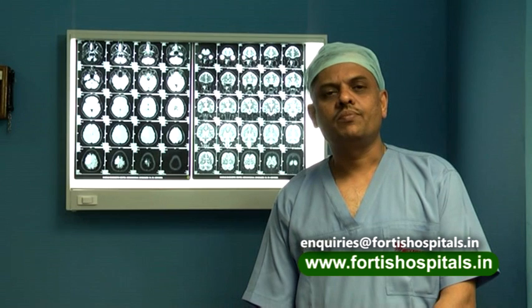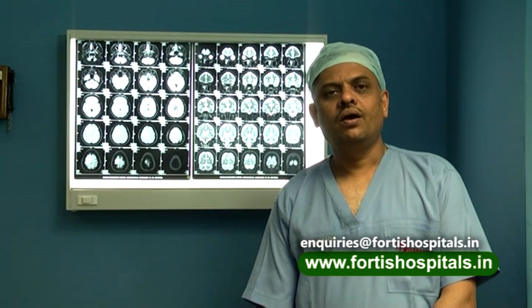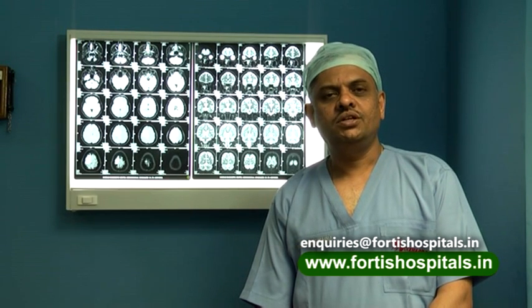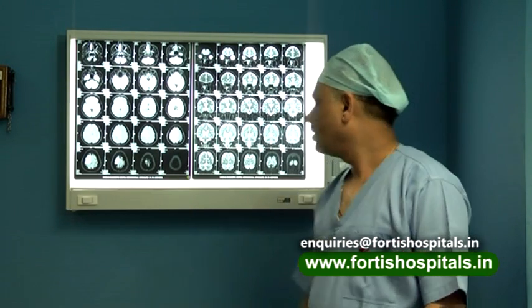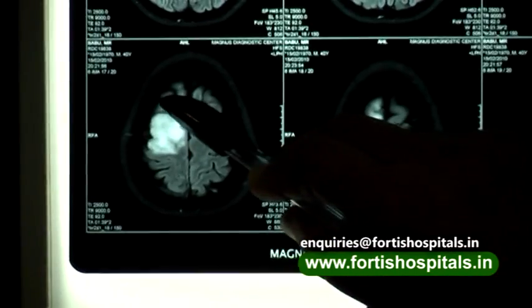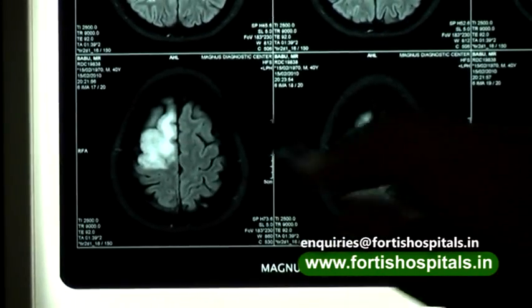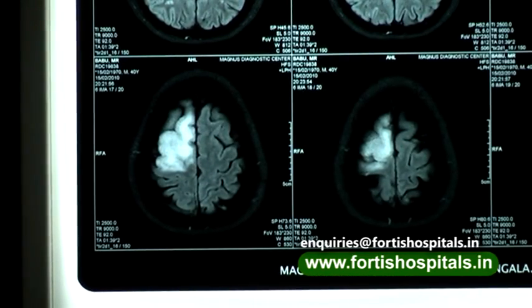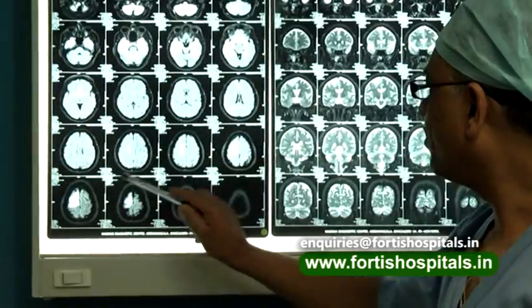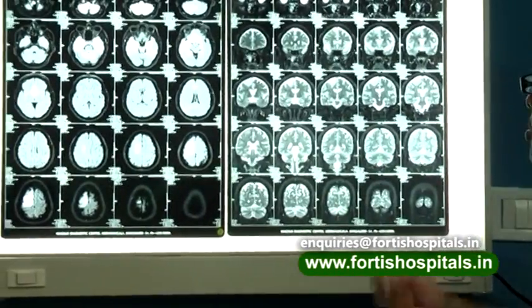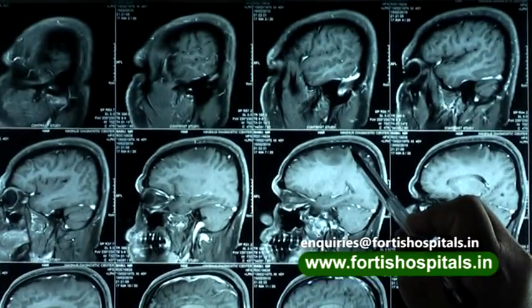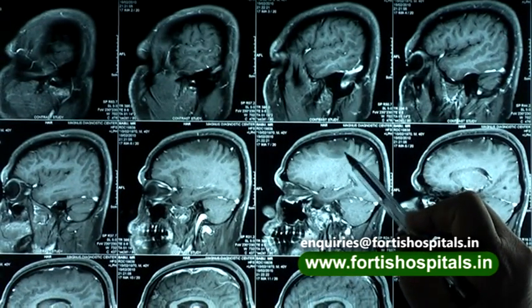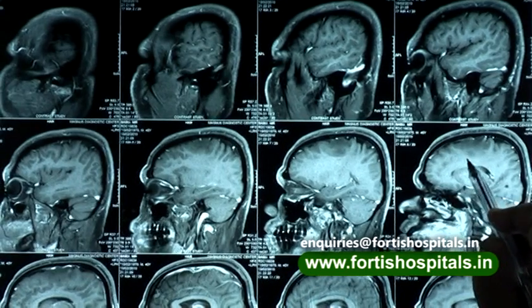Upon investigation with an MRI, the MRI showed a fairly large lesion involving the right side of the posterior part of the frontal lobe, predominantly the cortex and the subcortical region. As we see here in the coronal picture, that is the superior posterior frontal gyrus, right in front of the motor cortex.